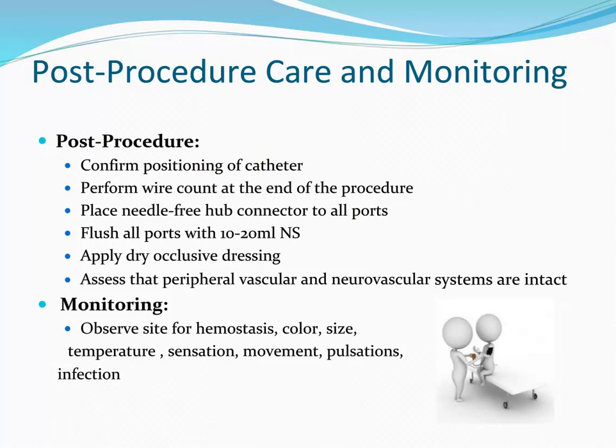Once access has been achieved, be sure to confirm the position of the catheter, first by blood return and later with a chest X-ray after the procedure. Femoral lines are the exception. A chest X-ray will not confirm placement here; the blood return will.